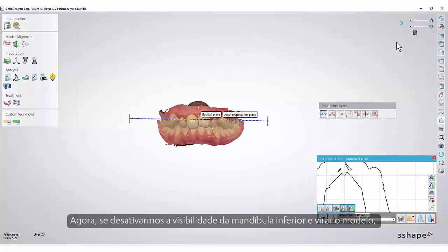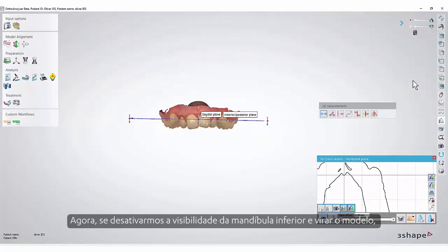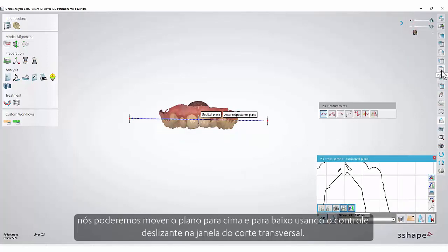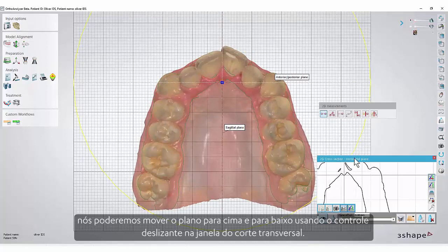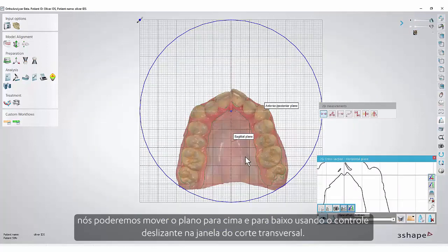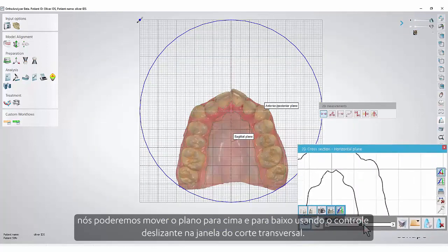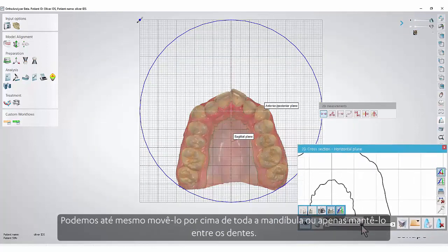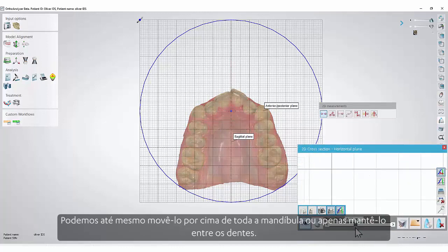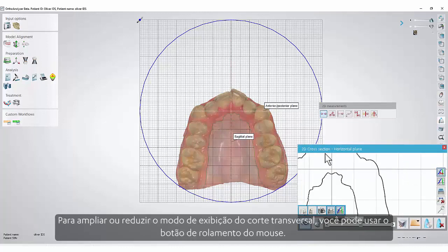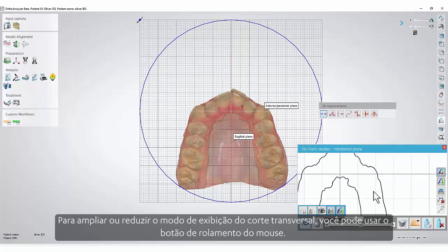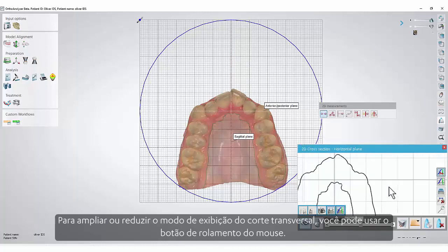Now, if we disable the lower jaw visibility and turn the model around, we will be able to move the plane up and down using the slider in the cross-section window. We are even able to move it all the way above the jaw or just keep it between the teeth. To zoom the cross-section view in or out, you can use the mouse scroll.